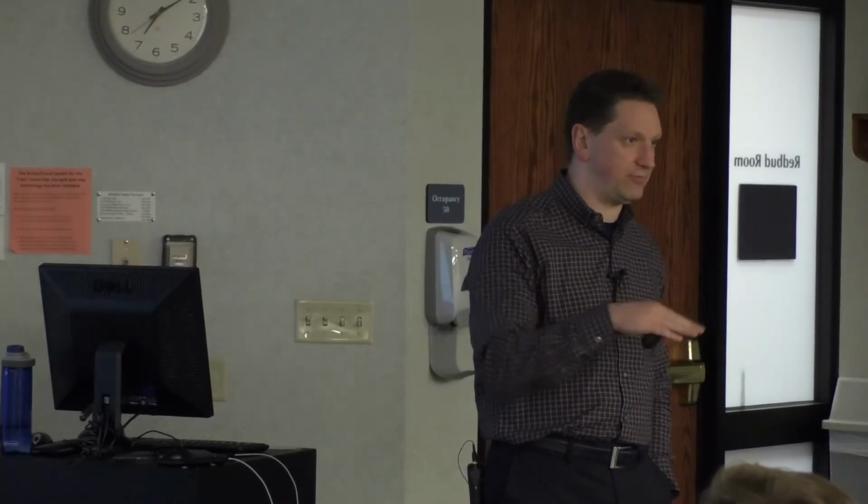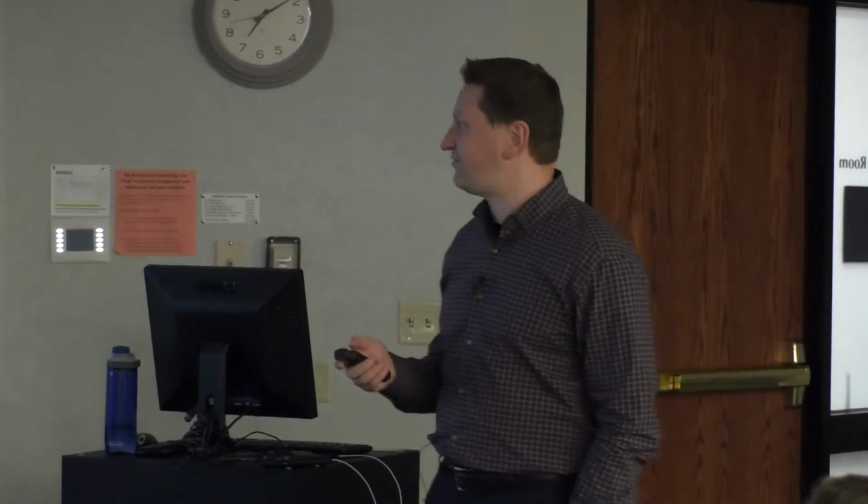ST segments we already talked about. They can be elevated, they can be depressed. Never call a change that's less than a millimeter. I mean, I see it, but all the significant stuff, all the clinically relevant stuff is going to be at least 1 millimeter.